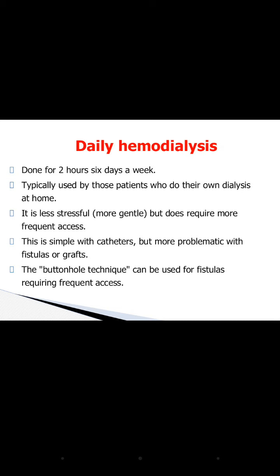Now daily hemodialysis is done for 2 hours, 6 days a week. So it is done daily, and 2 hours is taken for this procedure, and basically this is used for those patients who do their own hemodialysis at home.